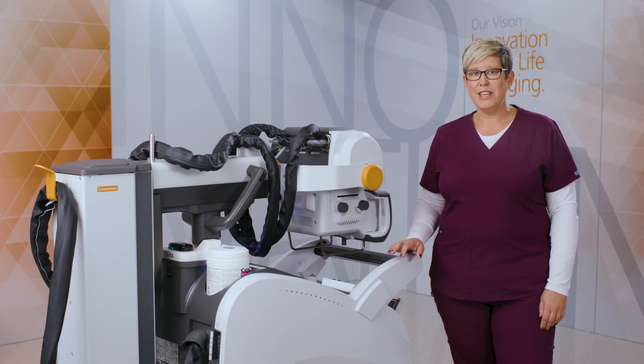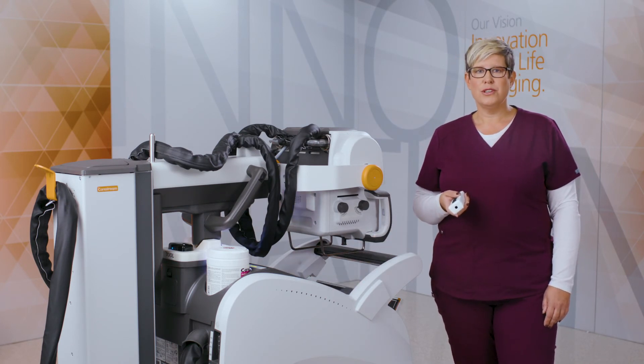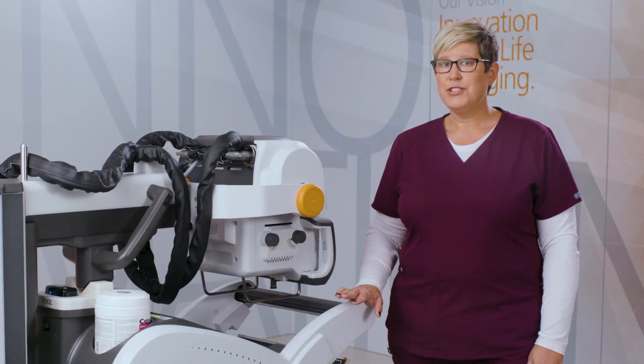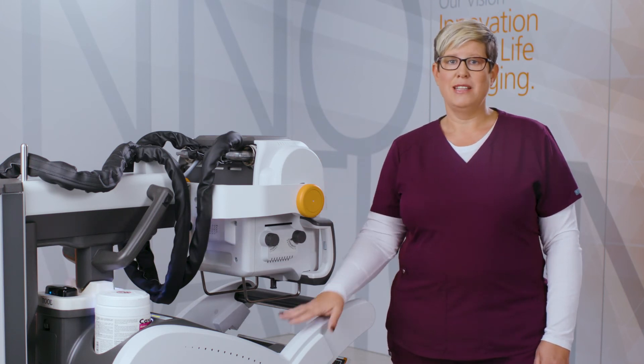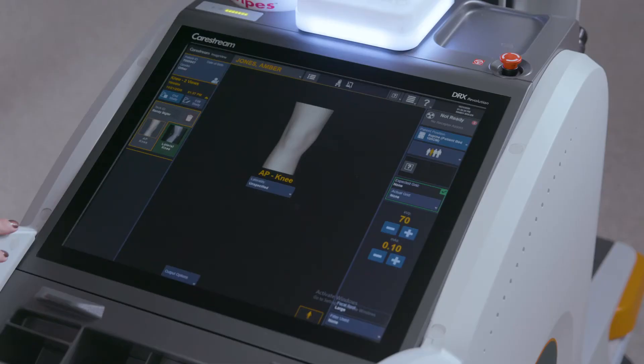Exposures can be taken by either the wired or wireless remote, which allows a user to be up to 30 meters away from the exposure. After exposure, a preview image is available on both the tube head display and main display for quick and easy viewing. ImageView software provides single screen viewing, so your commonly used functions and tools are all on the same screen, reducing the amount of button clicks.